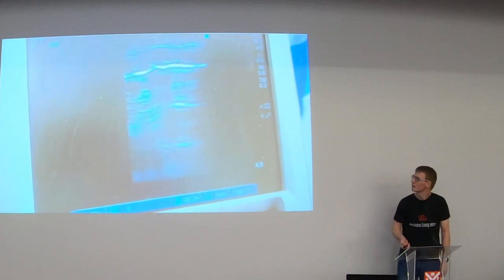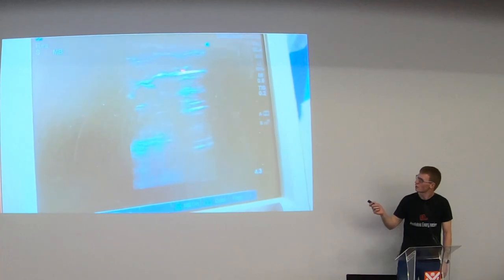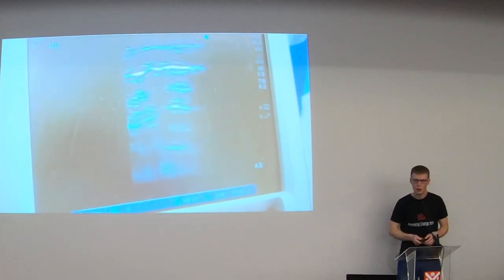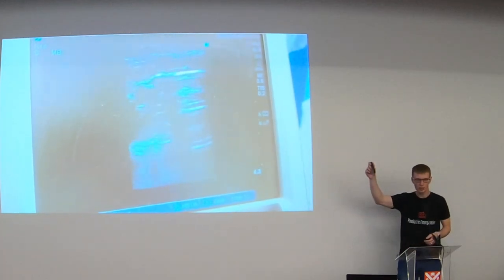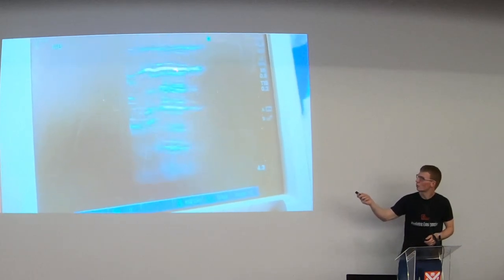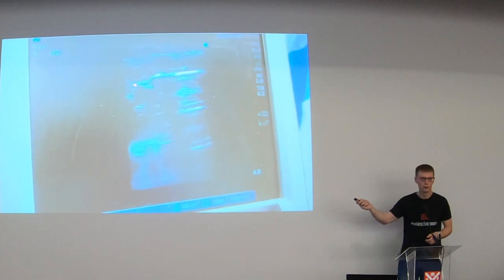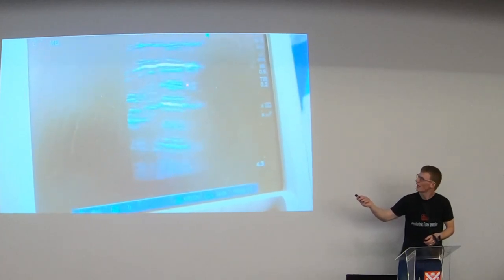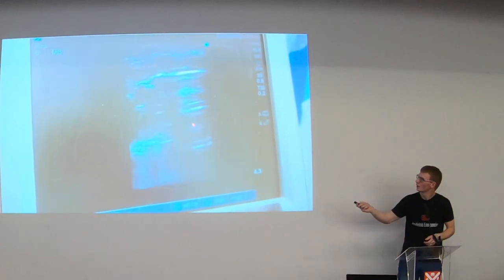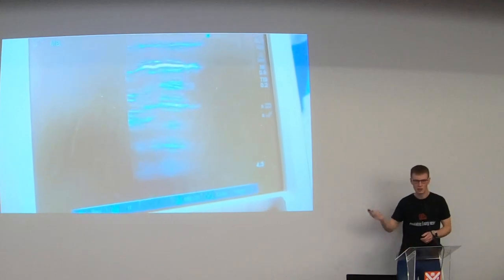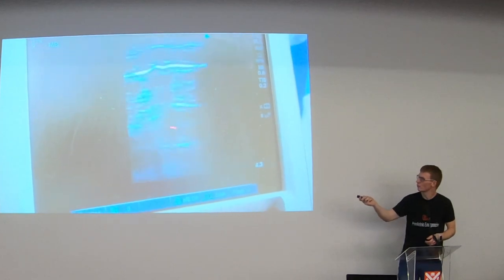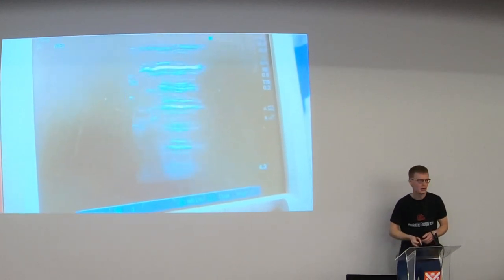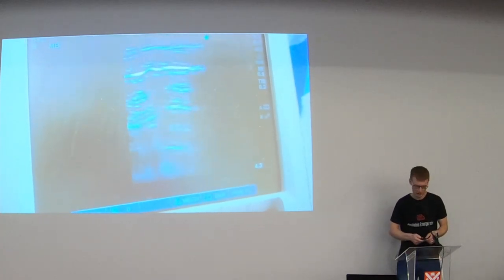So what does the pneumothorax look like? And this is it. So this time you've got a single layer of pleura. So this is the top layer of the pleura. And the problem is ultrasound waves don't travel well through air. You pick your probe up, hold it above your patient, you don't get a picture on the screen. So your ultrasound waves travel down to that first layer of the pleura and then they hit air and they can't actually travel down through that air. So what you're seeing is artifact down below here. And can you see this image here is repeated here and repeated here again. It's almost like mirror image you've got down below. That's what you get in a pneumothorax. It just depends how many times the waves bounce about before they come back to the probe. So a single layer of pleura, no sliding and shimmering, no comet tails coming off it, and mirror image artifact down below is a pneumothorax.